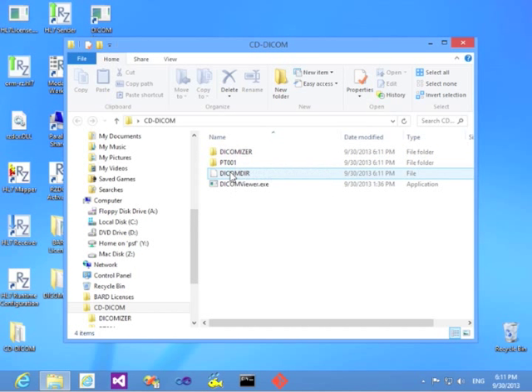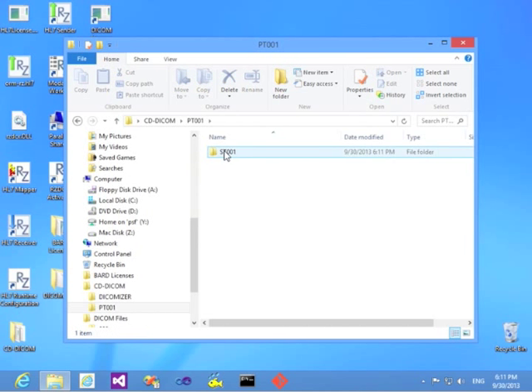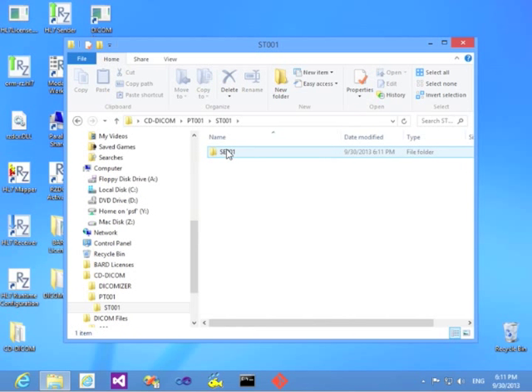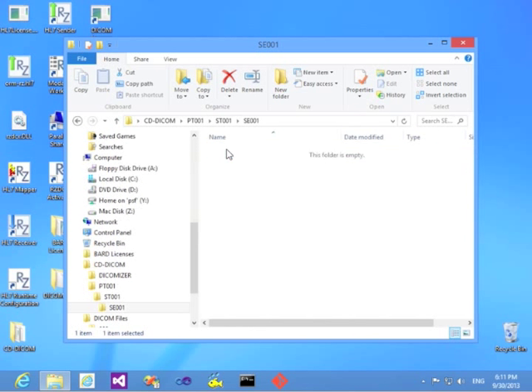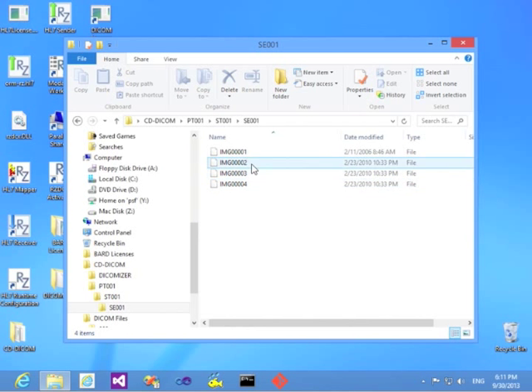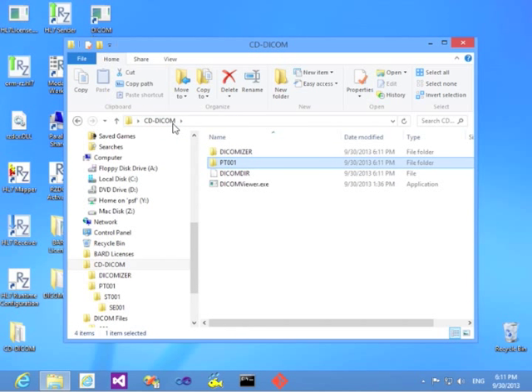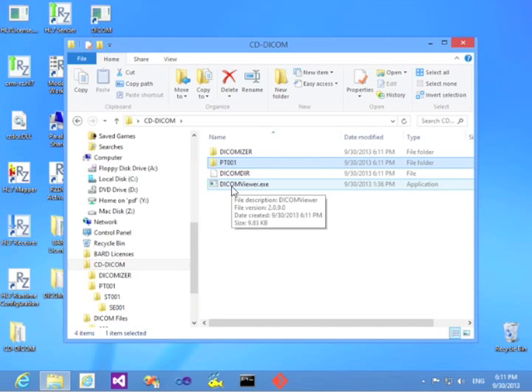And you can see the content of this folder. Here is a DICOMDIR file. Here is the folders where the DICOM files are and they are renamed according to DICOM Standard. And you can see we have an application here called DICOM Viewer.